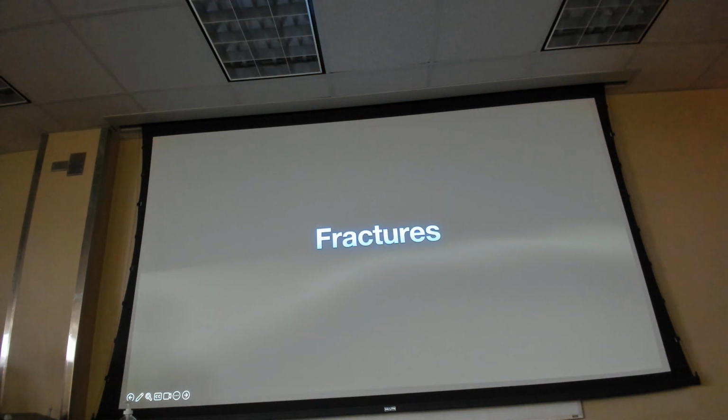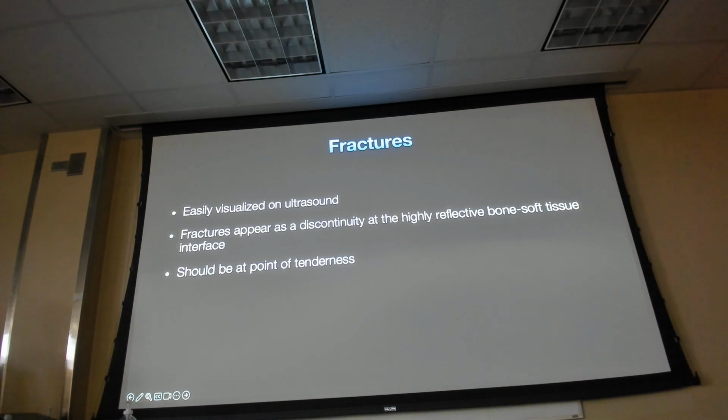Okay, fractures I think are going to be easier for us. I do this a lot for rib fractures because chest x-rays are really hard to discern. Even if you do a chest x-ray with rib series, most of the time we only care if the underlying lung is intact or not. Traditionally when somebody thought they had rib fractures, we do a chest x-ray, but we really don't care that much about the rib fractures unless they have a flail chest. It's just painful, especially in elderly.